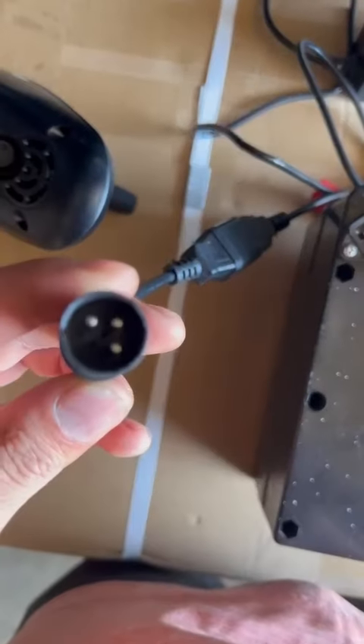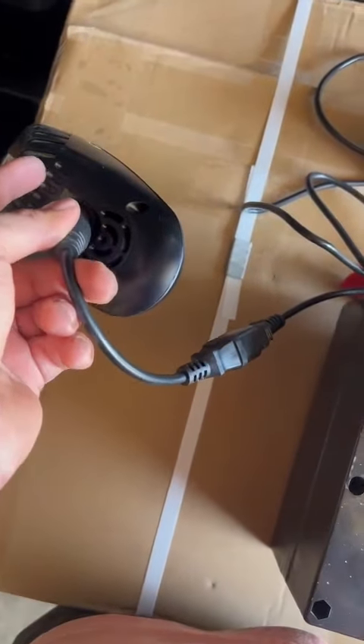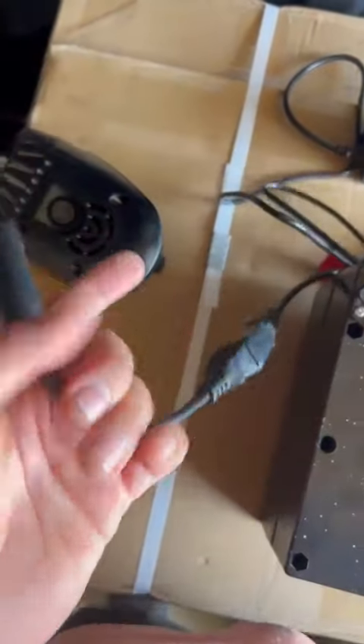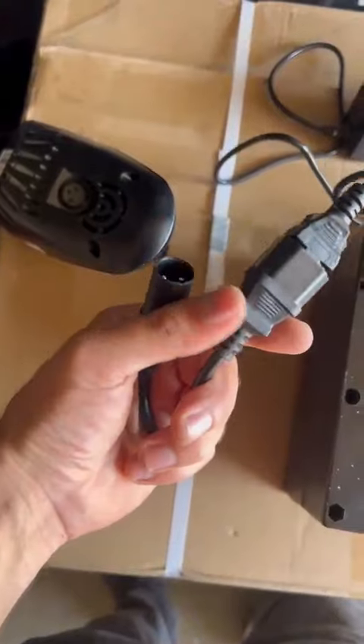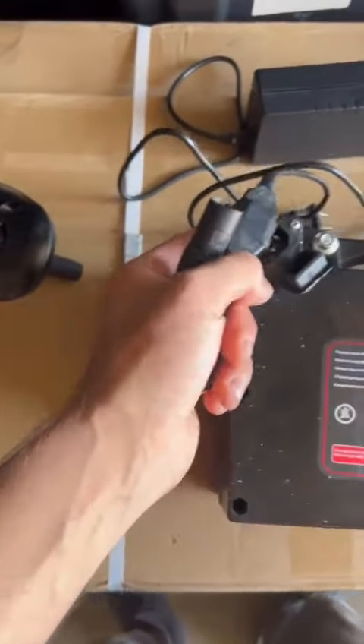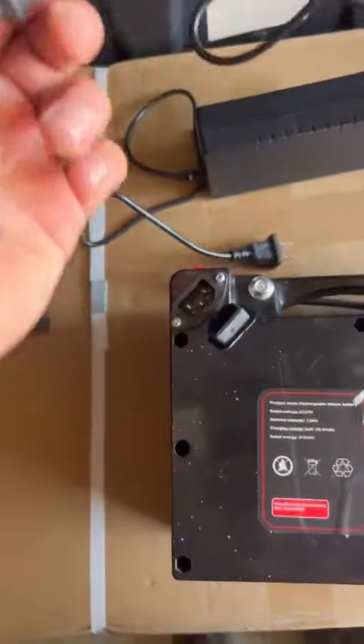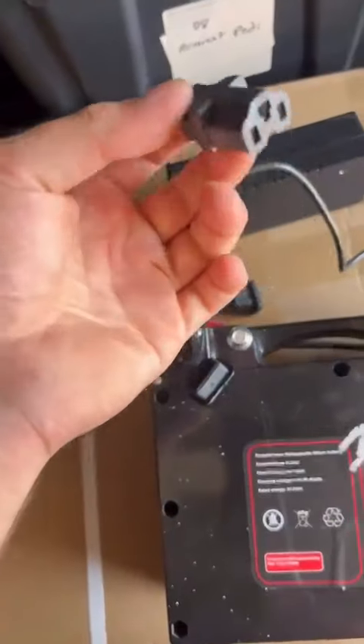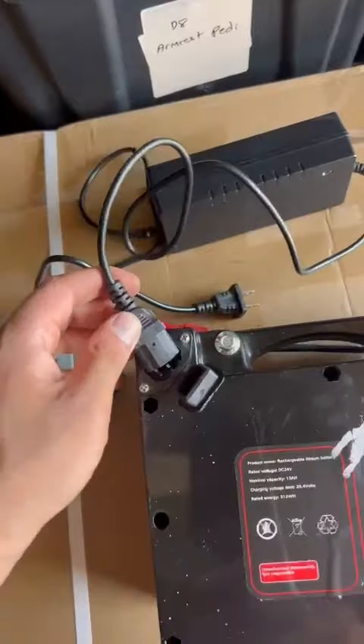This port goes here to the joystick to charge it. So this extension wire helps you charge from the joystick, not directly to the battery. If you want to charge directly to the battery, you have to use this wire here.